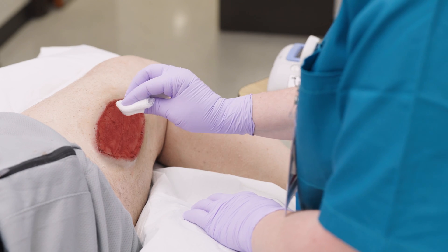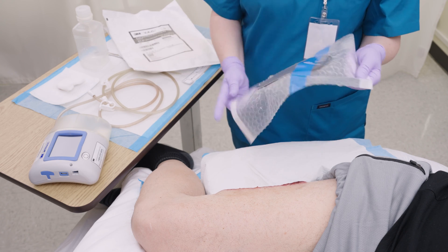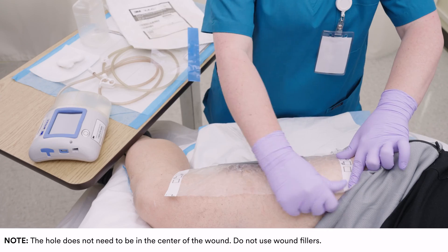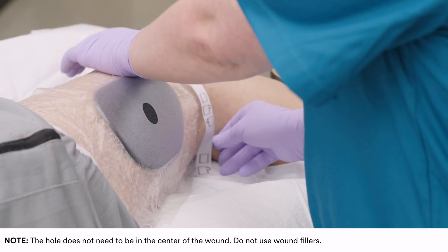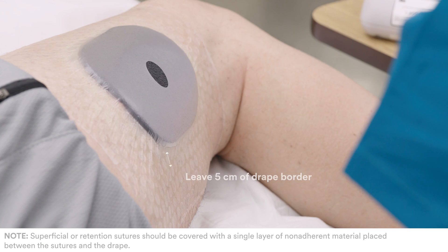Ensure the wound is clean. Open the sterile packaging and remove the two liners to expose the adhesive. Place the dressing onto the wound with the pre-cut hole facing up. The hole should be in the desired location of the 3M Sensatrac Pad. Leave at least 5 cm of drape border for sealing.